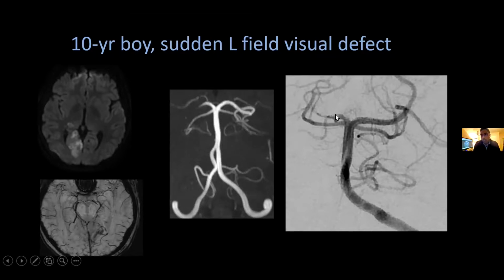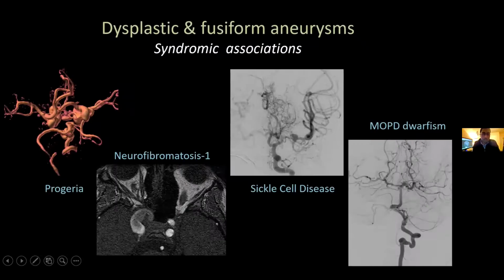But here you can almost see the second lumen where it has clotted off, and it closes the artery because of the acute clotting. It shuts down the artery, and these present as stroke. So this is exactly the same location. You can see the susceptibility in the clotted false lumen, and these can also present with strokes.